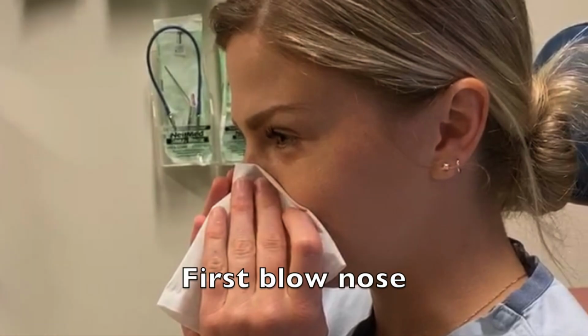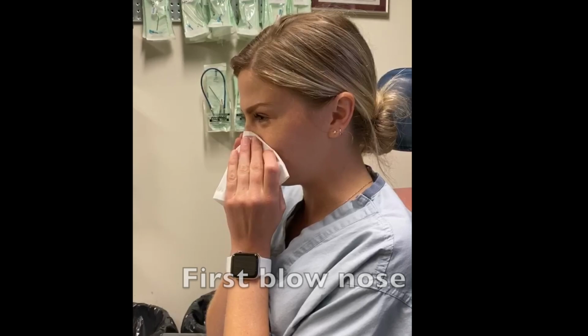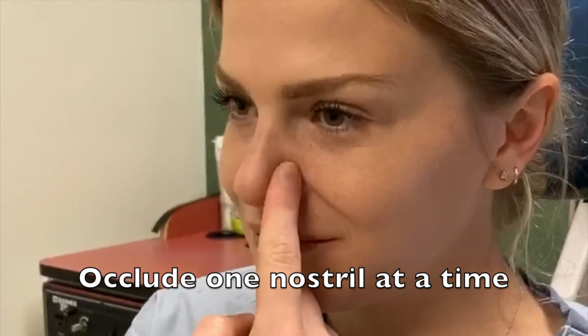To begin, have the patient blow their nose to clear the nasal passages. Then ask the patient which side of the nose they breathe most easily through. This can be tested by having the patient occlude one nostril at a time while breathing in, and thereby comparing both sides.